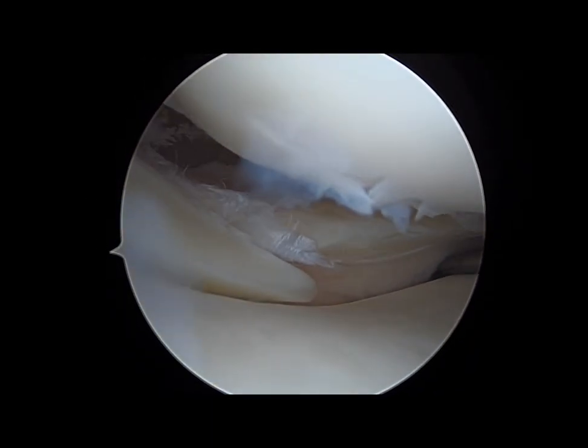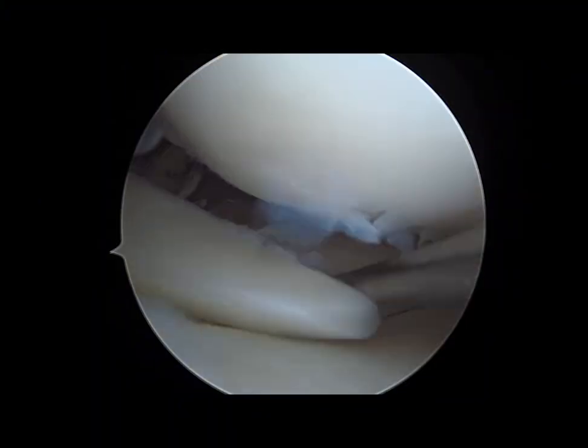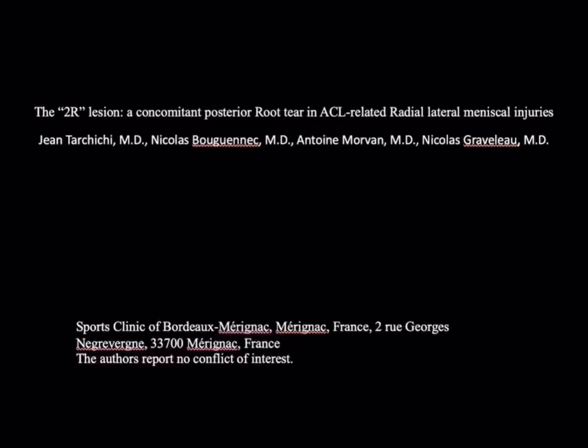Once the posterior root is clearly visualized, one should assess for a lift-off sign to eliminate a complete root avulsion of the posterior root, which isn't present in this case. In this case of oblique lesion, we opted for a repair with suture anchors and a regularization of the radial body tear, which isn't shown in this video.